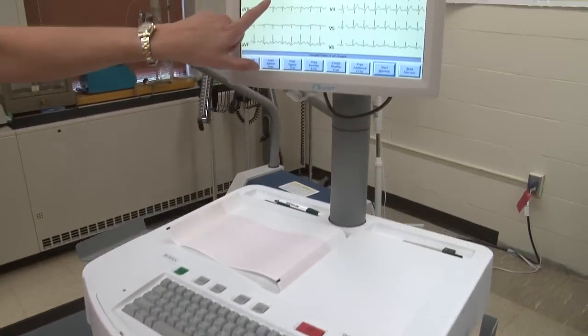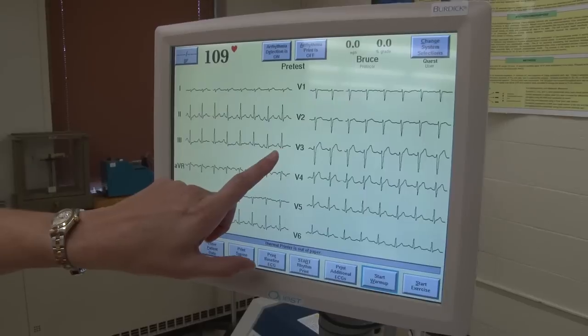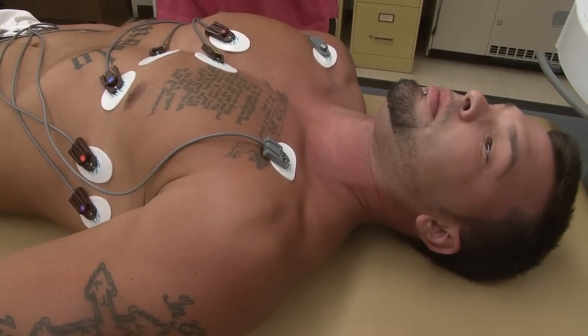Okay, you can see on the EKG screen that we're starting to see some ST segment depression, and we're starting to see some vibrations through there for artifact. I'm going to let Jake stop so he doesn't pass out right now. But what the clinician will have them do that for is to see if we can rule out a false positive test. That hyperventilation is simulating the same thing that the client would experience when they're doing intense exercise, the breathing pattern that they would experience then. So if we see that this is just what happens with Jake when he breathes heavy on the EKG, then we can rule out that that's really not a positive test. That really, in fact, it is just Jake's normal breathing pattern and what happens with his heart when he's breathing heavy.